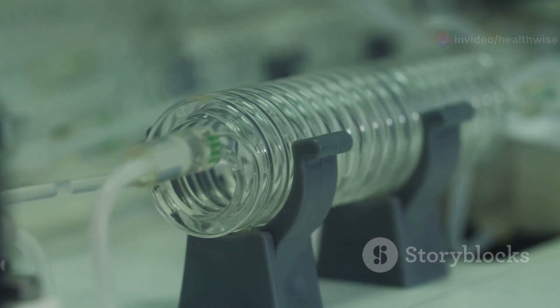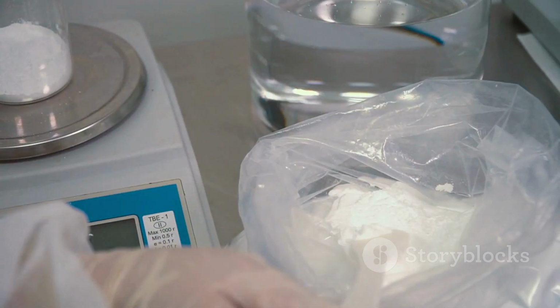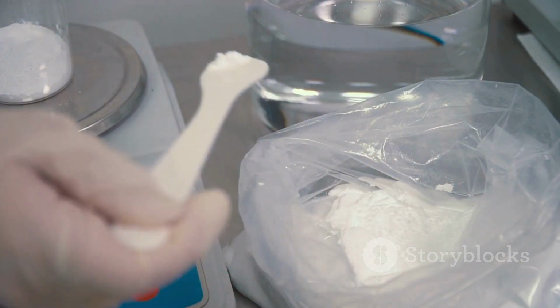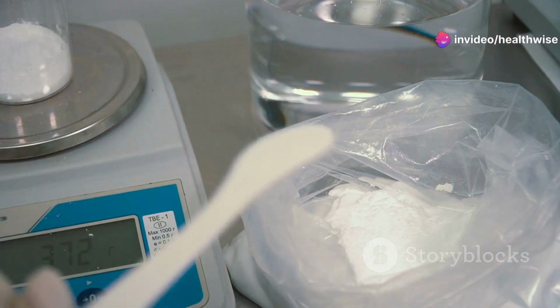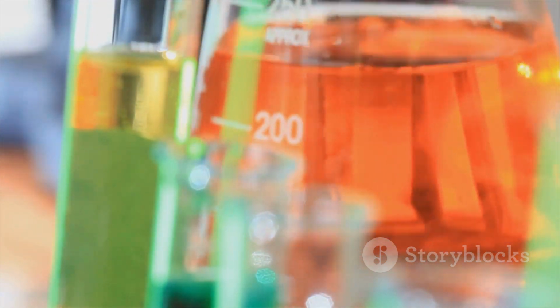You'll need a stock standard solution. To prepare this, dissolve 360 milligrams of pure dried analytical grade glucose powder in 100 milliliters of a saturated sodium benzoate solution. Sodium benzoate is a preservative, but you can skip it if you're using the glucose solution immediately.